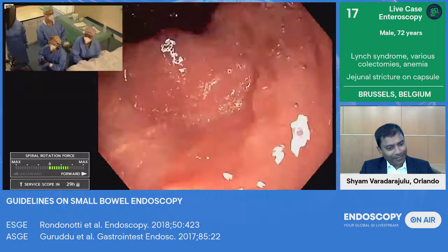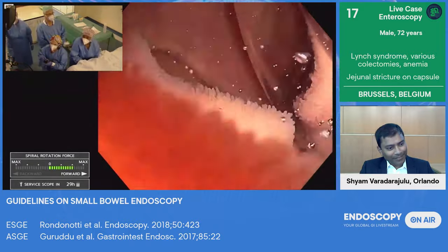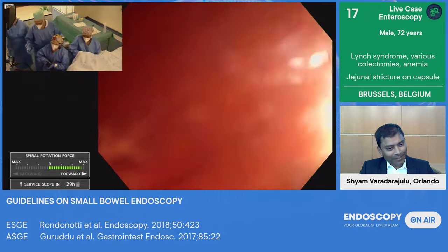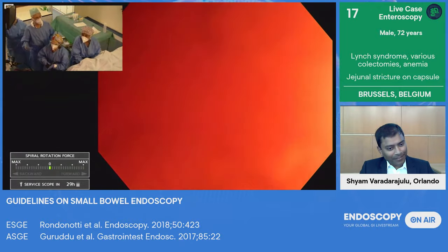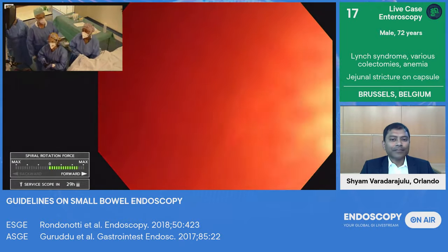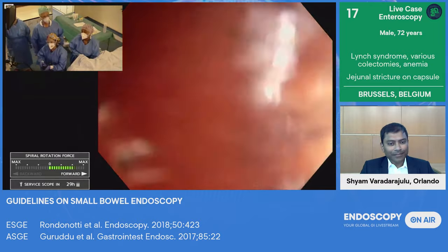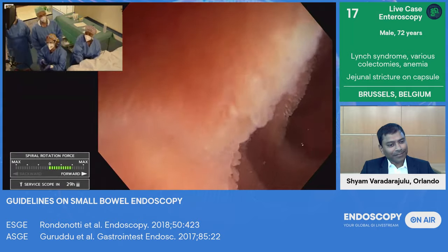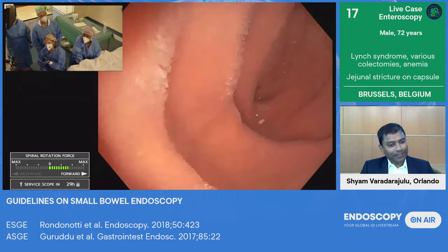Sometimes when you see a good progression, we don't see yet a very fast progression, but sometimes with a good progression, you can even keep the endoscope in forward move when you don't have too much resistance, and then it will pass the angle by itself.